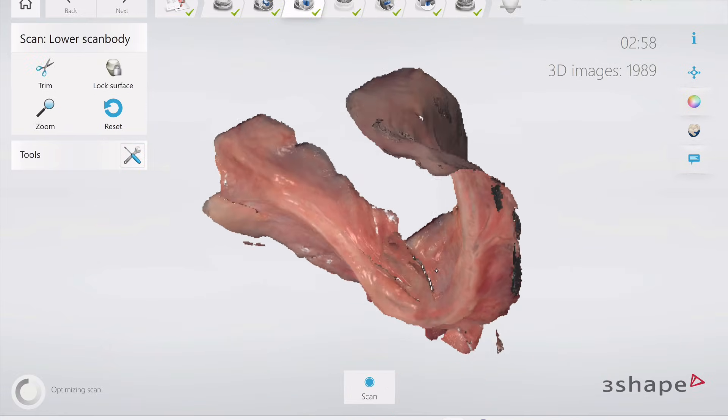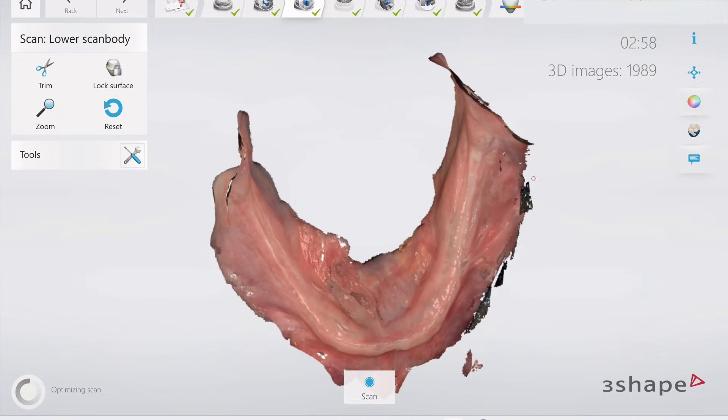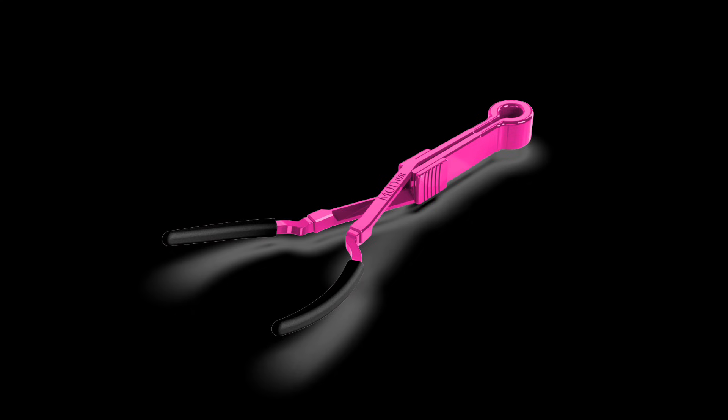And look at this scan — this is insane how much detail we've been able to capture in such a short amount of time. This is what the Mod Retractor is able to do, years in the making. I'm so excited to be finally releasing it for you guys.